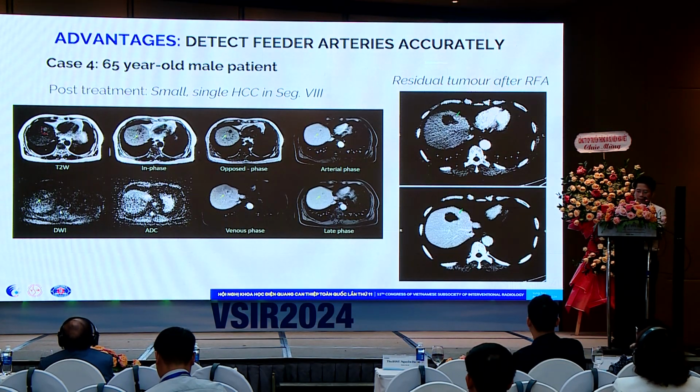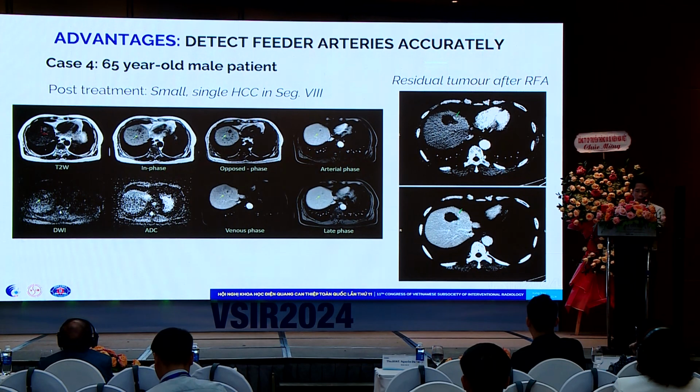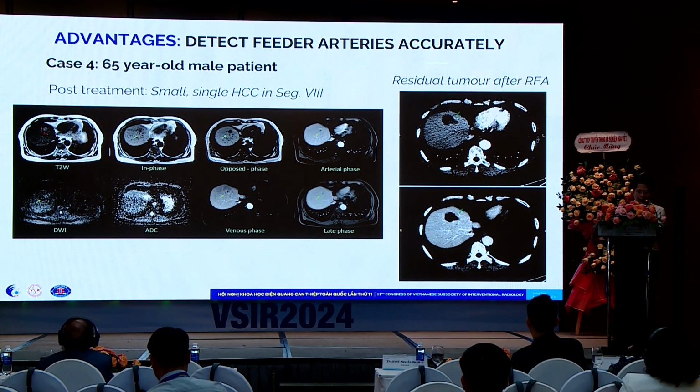Another advantage of angiosync is that we can find the feeding arteries more accurately and easily. I want to show you the fourth case, a 65-year-old male patient, and he has a small HCC in segment 8. He was treated with RFA, but unfortunately the ablation zone did not reach the target.